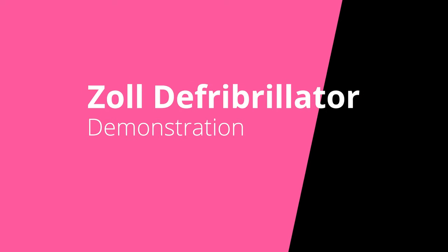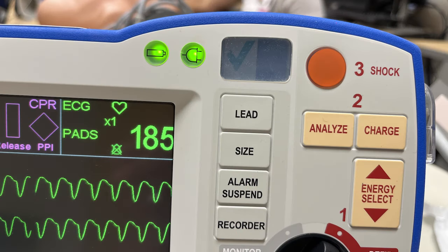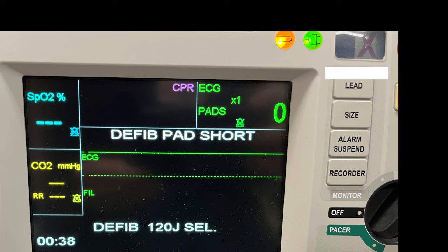In this video we're going to go over the Zoll defibrillator. When you're going to use the Zoll defibrillator, the first thing you want to check is to make sure you see these two green lights and this green check mark on the top of the machine. If you ever see a red X, you cannot use the defibrillator until the red X is fixed.